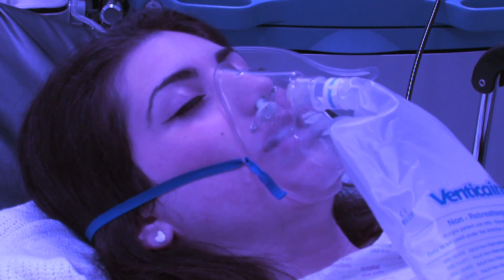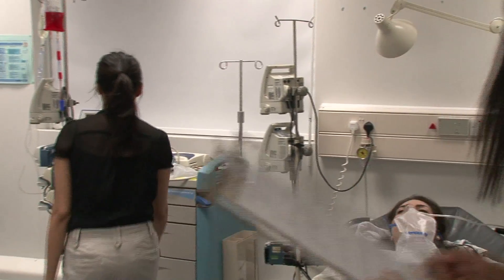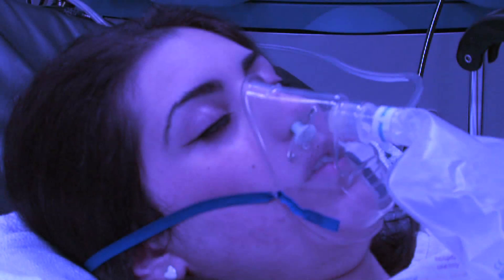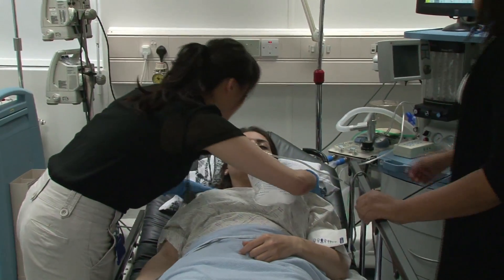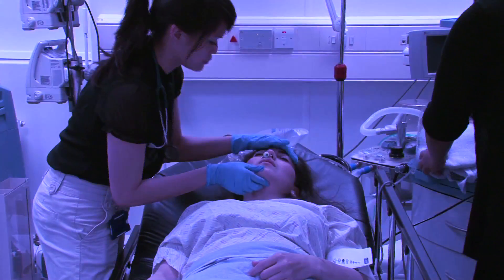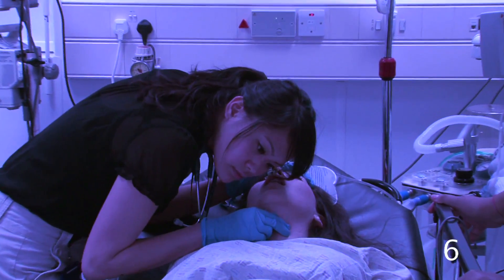Now that you have secured the airway, you can continue with your ABCDE approach. Her mask has stopped misting. This suggests that the patient is no longer breathing. You should now recheck for a response. Ivy? Can you hear me Ivy? Open your eyes. As there is no response, you should open the mouth and check for obstructions. Then you should check for signs of life for up to 10 seconds.